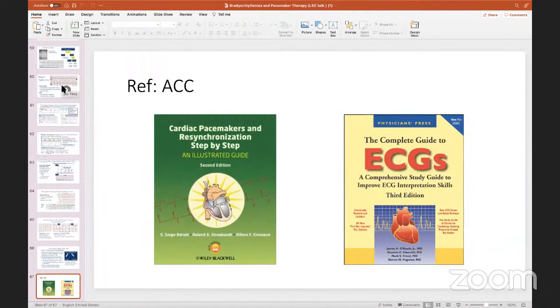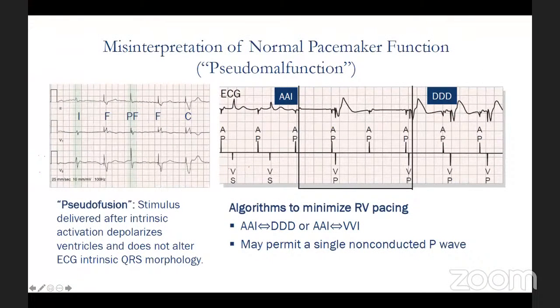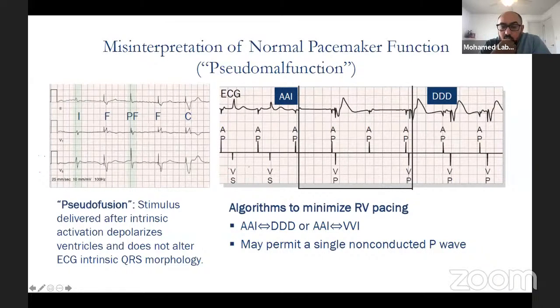I have a question on slide 65, when you talked about pacemaker troubleshooting. You said the mode is AAI, and when explaining, there is V sensed. So when the mode is AAI, do we still sense the V? Good question.